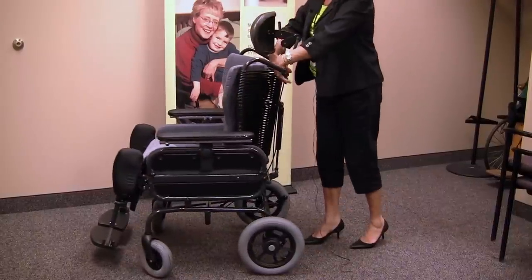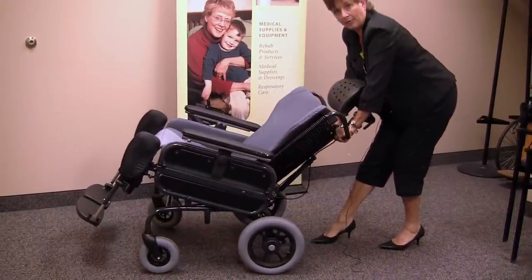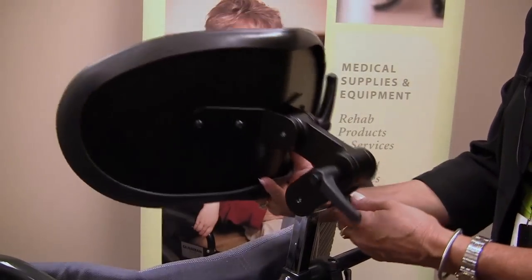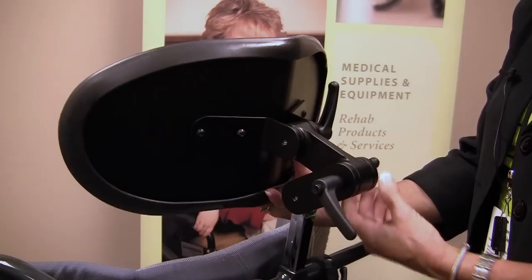The features of this chair include tilt and recline. We have a four-point adjustable headrest to accommodate all various posturing and positioning needs.